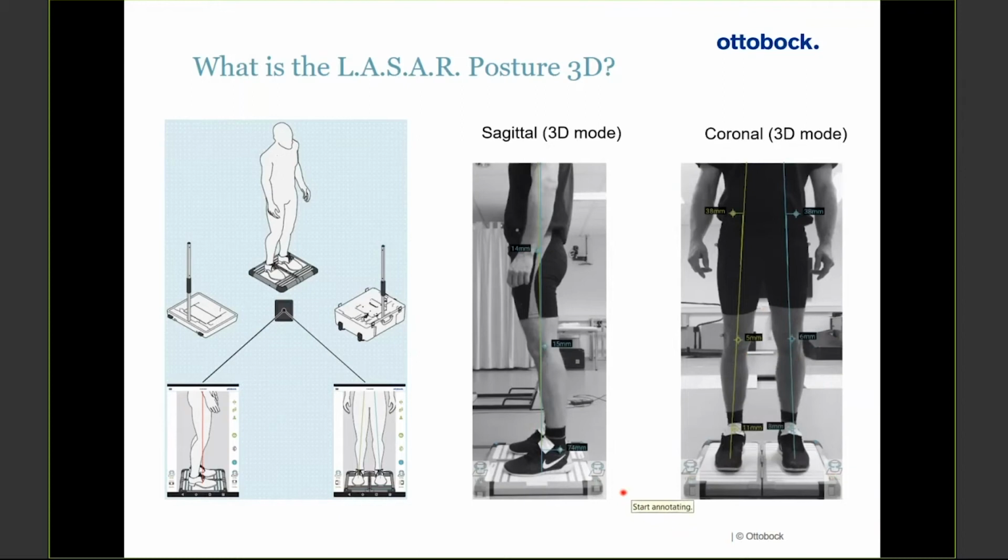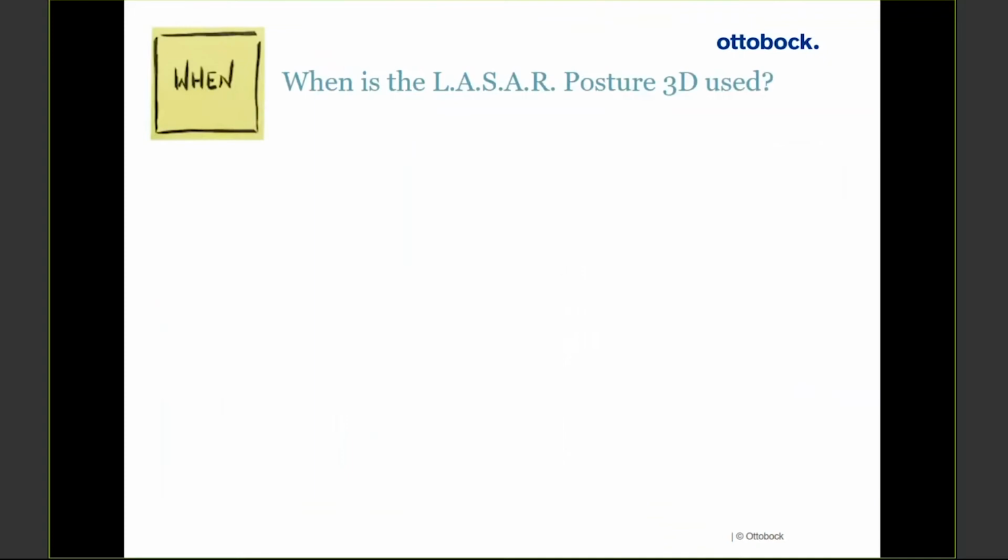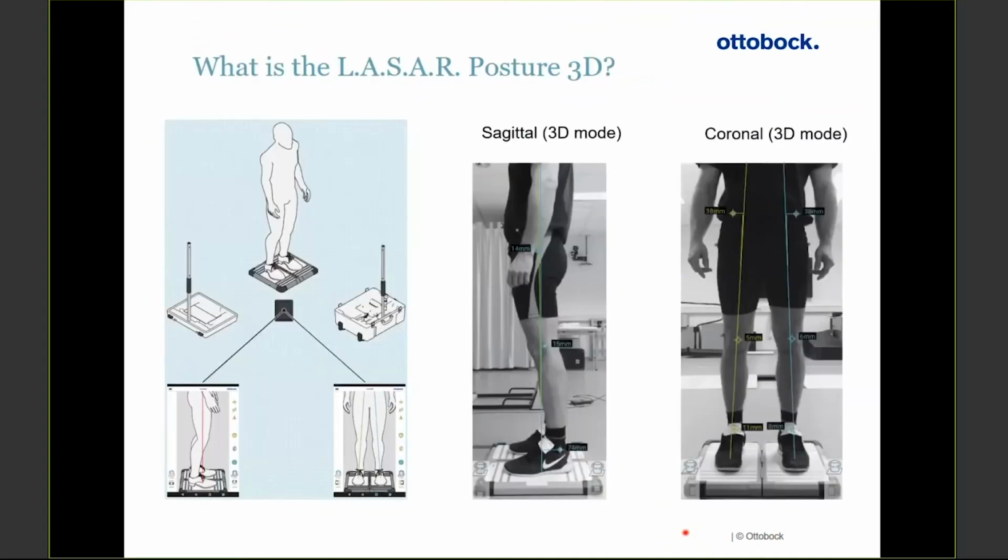So we have natural stance here. This person has got no affected limbs. And you're seeing here that the 2 ground reaction forces are meeting at the same place, at the same center of pressure at the foot, and they are essentially overlapping. And this is the ideal alignment that we're trying to achieve. You can even see in that previous slide, Aideen, how the patient's resting on the ligaments of Bigelow at the hip. So he's actually pulling back in hyperlordosis.